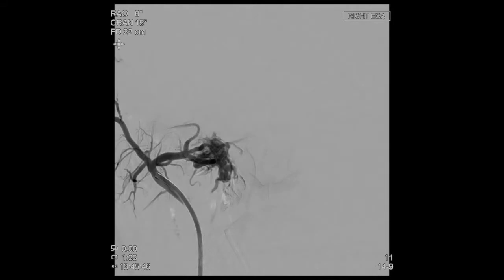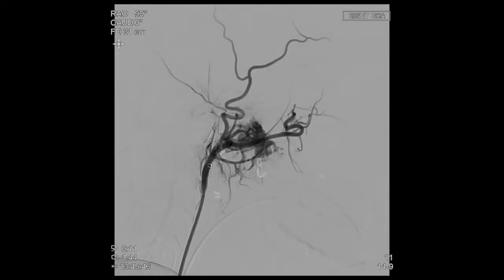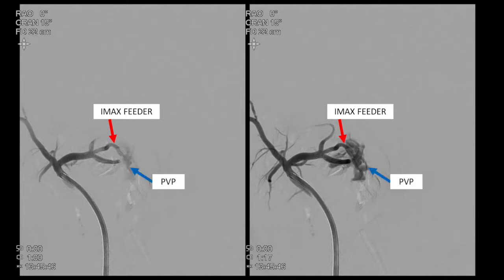Here we see an arteriovenous fistula between a branch of the internal maxillary artery and the pterygoid venous plexus. On the unsubtracted images, you can see multiple densely calcified phleboliths in the soft tissues of the face on the right. The angioarchitecture of the fistula is better demonstrated here, where we see an internal maxillary artery branch which is diving directly into the pterygoid venous plexus. We suspected that this would be a single hole fistula.